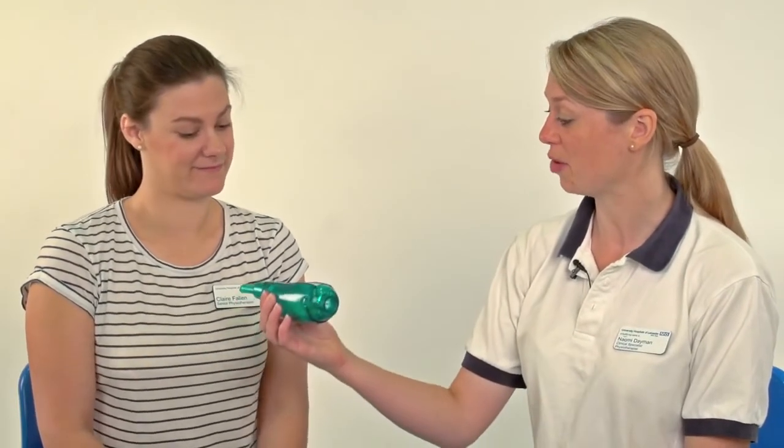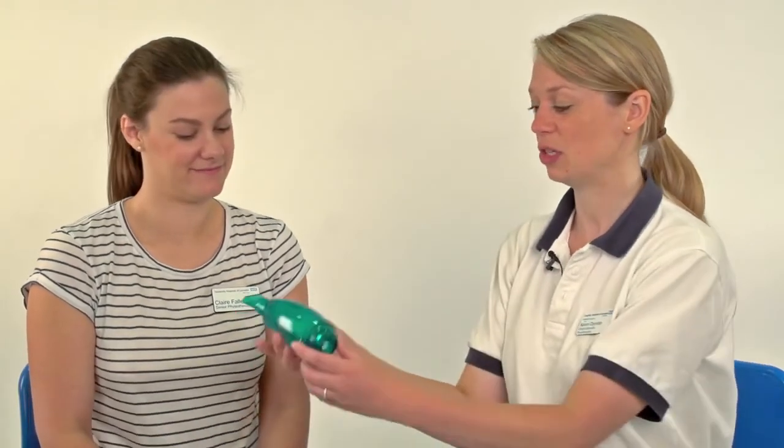Do I have to sit up when I do it? No, not always — it can be done in other positions as well. Ideally we don't want you doing it lying flat on your back, but you could do it lying on your side in a more upright, crooked position. You can actually do it blowing it upside down as well and it will still work. So if you're a parent and your child is tipping it upside down, that doesn't matter — it still works just as effectively. We would normally teach it this way up, but it can be done the other way too. We say don't do it lying flat because it's not as easy to clear your chest or take as big a breath when huffing and coughing, but lying on your side is fine.